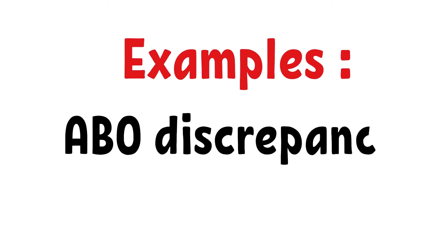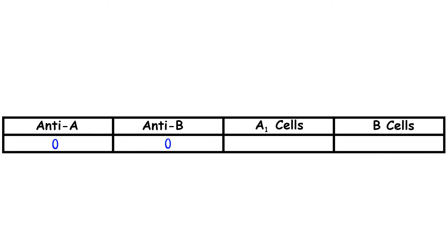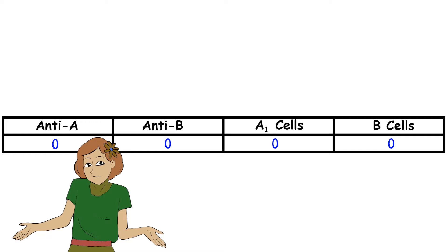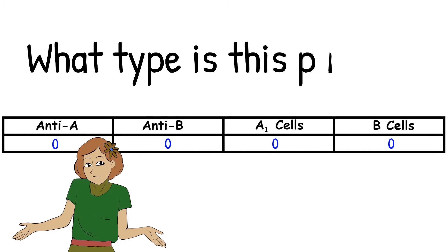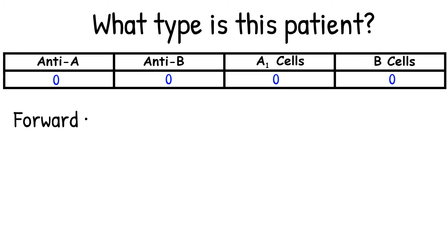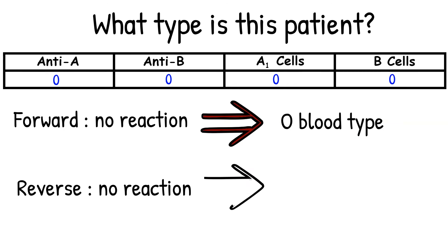Let's take a look at some examples of ABO discrepancy problems. Take a moment to look at this reactivity — you can pause the video if you need more time. What blood type do you think the patient has and how would you approach this problem? When you look at this reaction, there are no reactions in either forward or reverse. Looking at the forward reactions, you get O blood type. Looking at the reverse typing, you get an AB blood type.